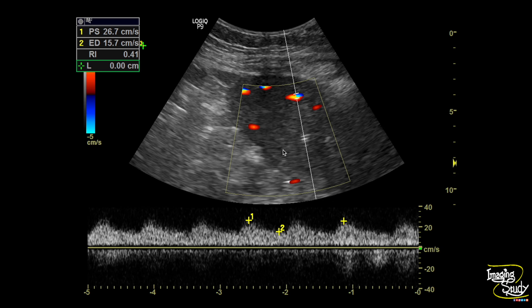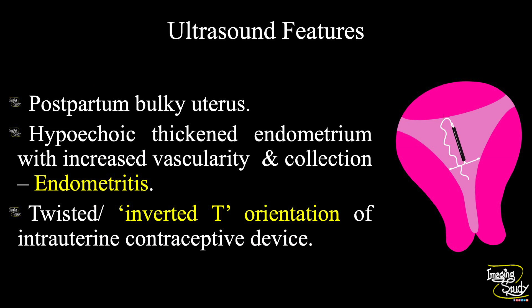The color Doppler showed the predominant supplying vessels towards the endometrium with a low resistance wave pattern, possibly due to inflammatory change. In summary: a postpartum bulky uterus was noted, with hypoechoic thickening of the endometrium, increased vascularity, and endometrial collection — all going in favor of inflammatory change. There is an echogenic intrauterine contraceptive device which appears twisted or inverted T-shaped in orientation.